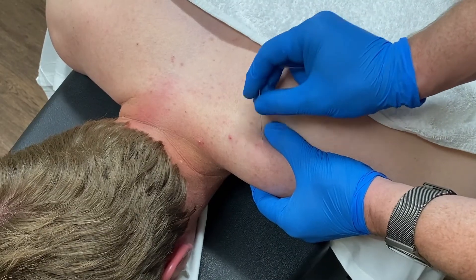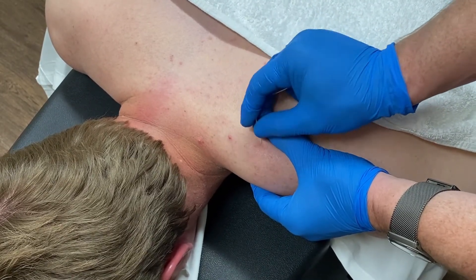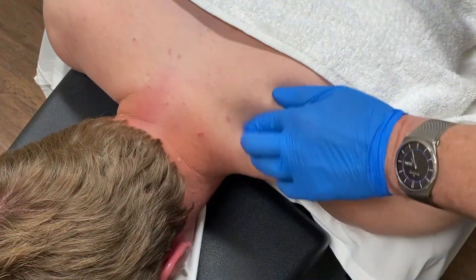Needle the tissue between your fingers. Keep the needle in front of your thumb and do not angle it towards the thorax.